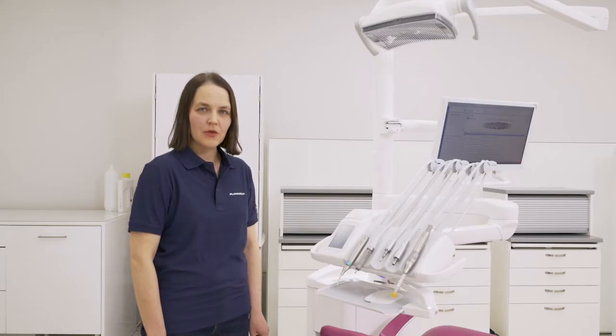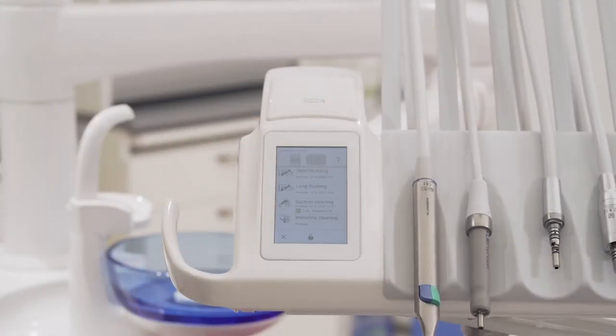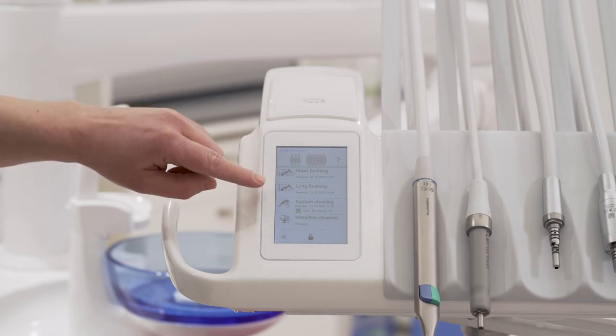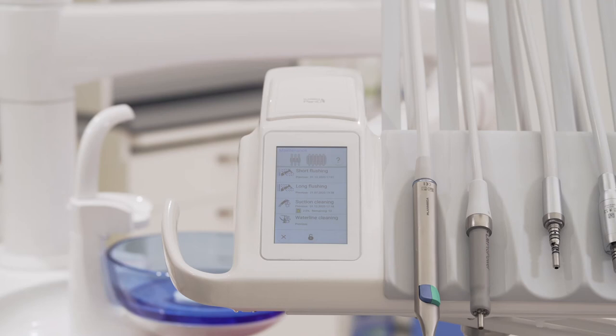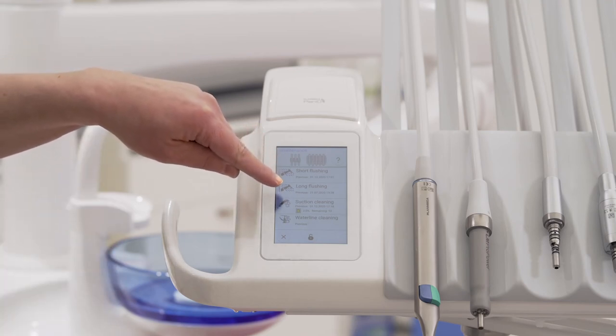The maintenance menu includes instrument flushing programs: short flushing between patients, and long flushing at the beginning and end of the working day. You can also see the timestamps of previous flushing programs.